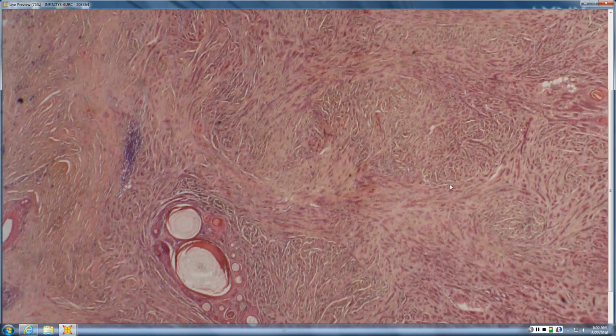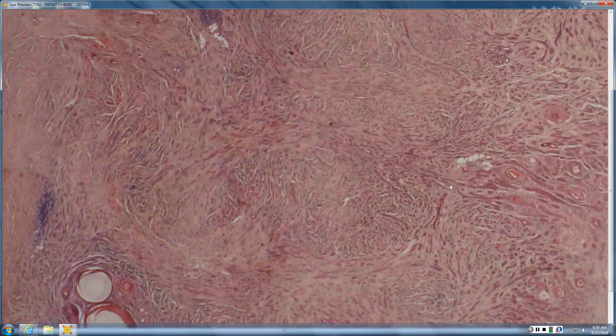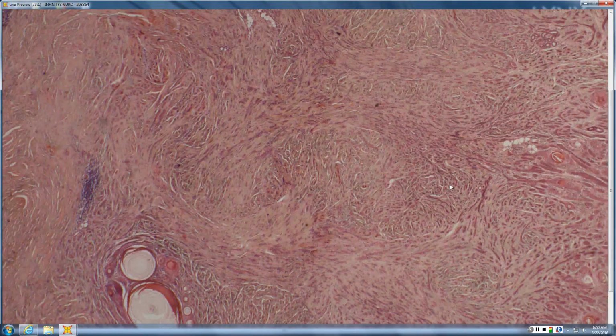Now that is in contrast to this. This is a ginormous tumor, and this is a microcystic adnexal carcinoma. Let me just make sure, yeah. And so I'll go ahead and get into the Paisley-Tie now.